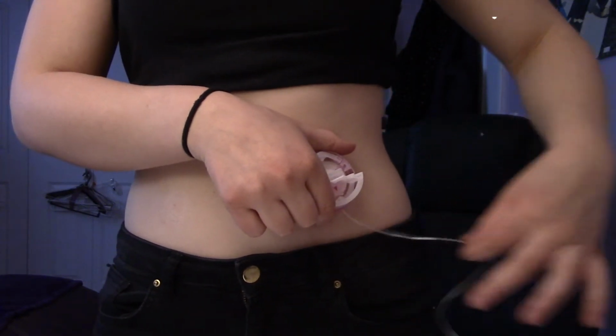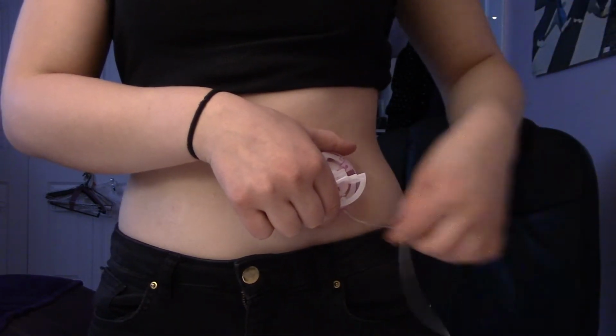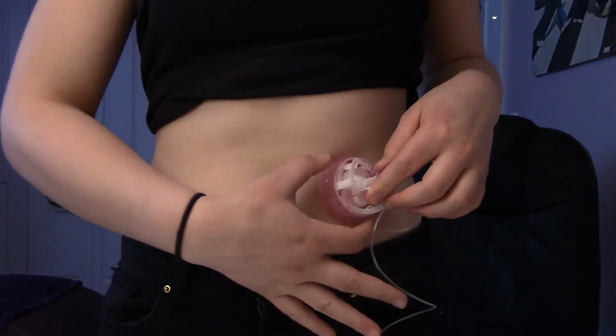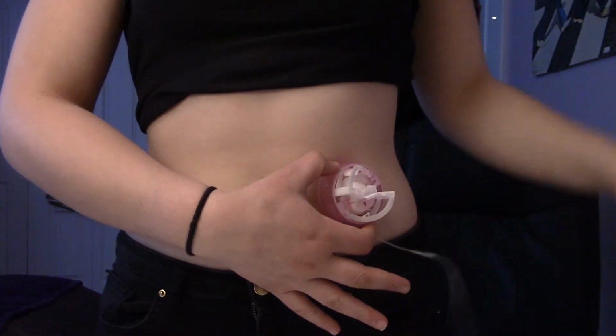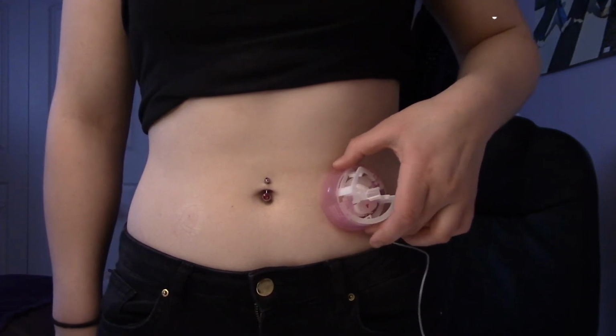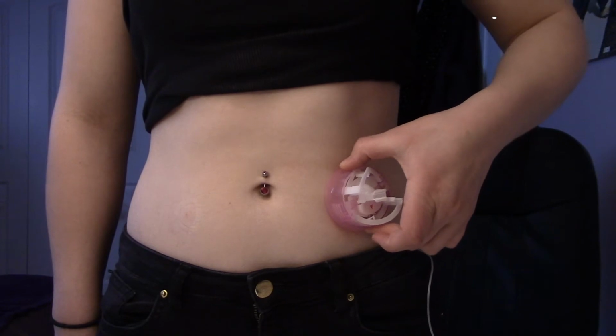I like to have this part dangling down. That way it's moving in the direction to where my insulin pump's going to hook on. It's telling me it's ready. All right, so now I'm going to press those two indent sides and it should just pop in. Sometimes this hurts, most of the time it doesn't. It's really dependent on the day. So here we go, you should hear a nice pop.